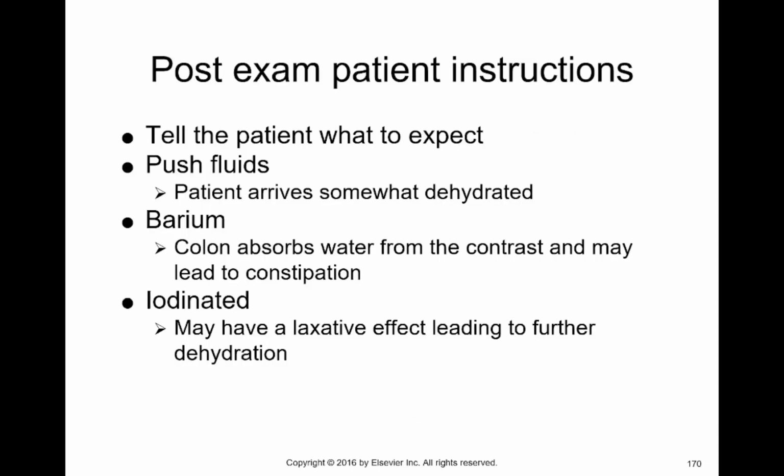So post-exam procedures, tell the patient what to expect. That barium is going to come out of the patient looking just like it went in. So don't digest it. They've been NPO. Their bowels should be pretty well empty. So it goes in white, it comes out white. And what we need to do is tell the patient to push fluids. And that is because the patient arrives somewhat dehydrated.